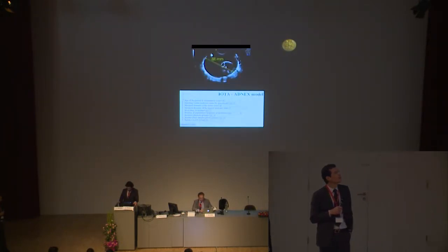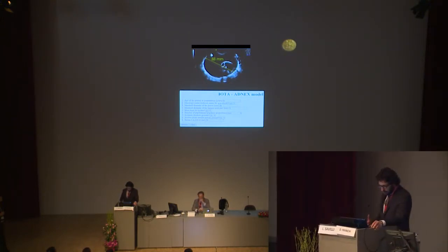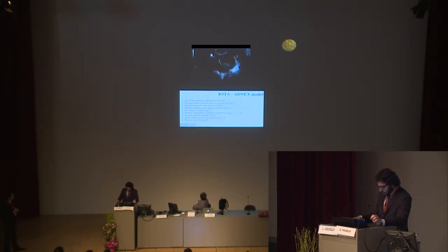A different mass. We know that in clinical practice there are masses which are very difficult, even for expert operators, to state whether the mass is benign or malignant, and around 6, 7, 8% of the masses belong to this class, and maybe multilocular masses are one of those. So this is one of those masses difficult to classify, 88 millimeters in maximum diameter, the patient 55 years of age. There were no papillations and more than 10 locules, no solid portions, no acoustic shadow.